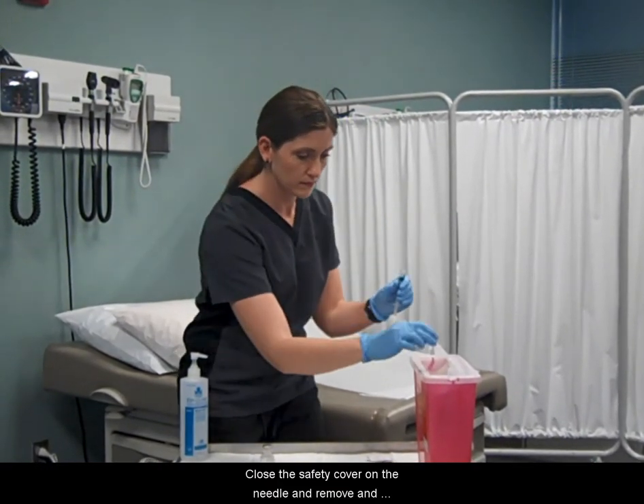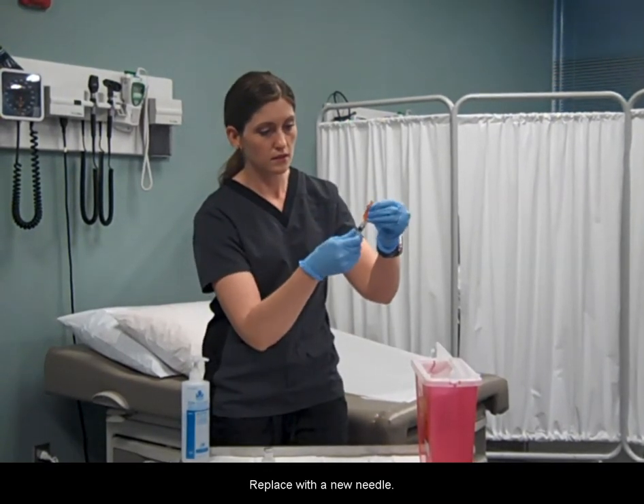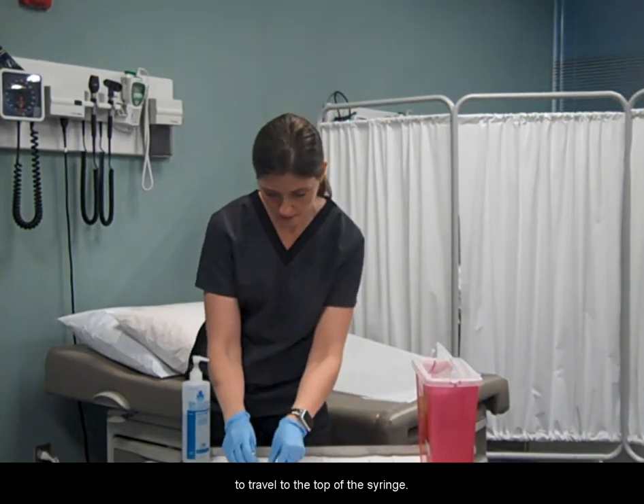Close the safety cover on the needle and remove and discard in the sharps container. Replace with a new needle. Gently tap the barrel of the syringe to allow air bubbles to travel to the top of the syringe.